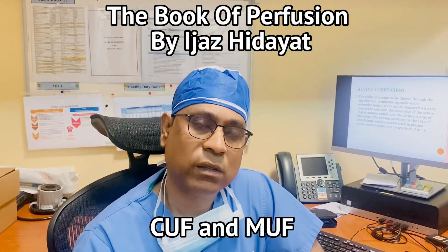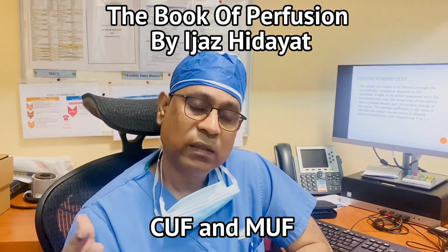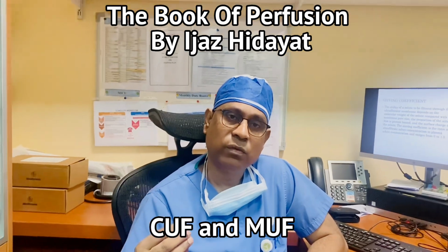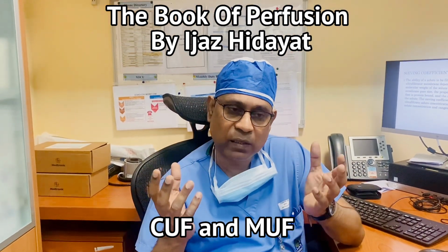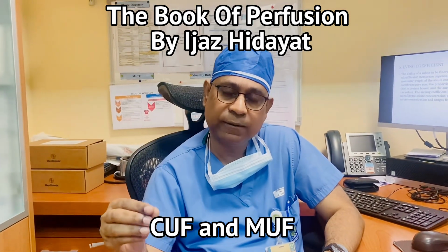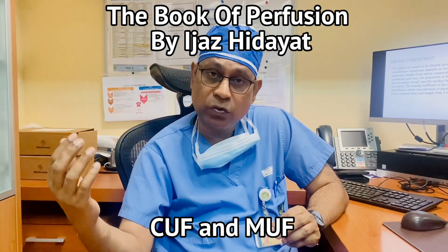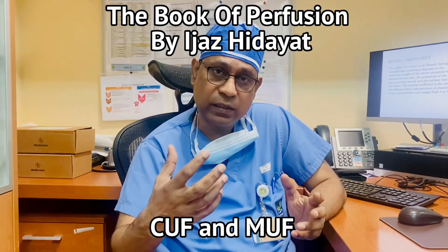Now the question is, when are we going to use the terms CUF and MUF? CUF is conventional ultrafiltration and MUF is modified ultrafiltration. CUF is performed during the bypass surgery, especially in pediatric surgery. We design a circuit where we connect the inlet of the hemoconcentrator with the arterial line, which takes oxygenated blood from the arterial side into the hemoconcentrator.